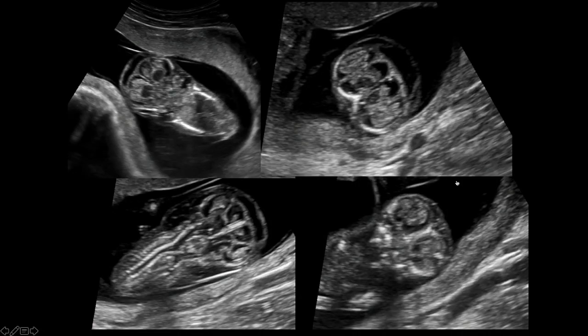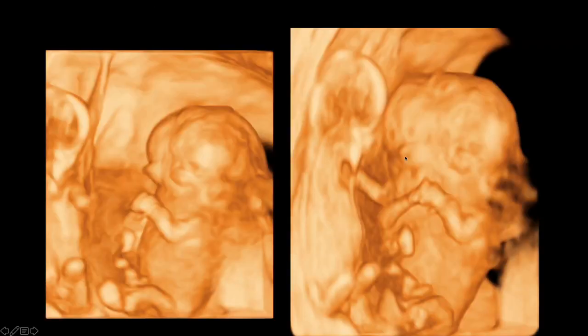A talk on the fetal face wouldn't be complete without a talk about duplication abnormalities and conjoined twins. This was actually, interestingly enough, a set of, I guess, twins or triplets, if you want to call it that. There was one singleton out here, and then this fetus here was actually partly duplicated. You can see the two spines here and part of the two brains here, but then everything is fused in here. And then you can see that there's probably 3 orbits. We don't see the middle one very well, but it looks very, very unusual.